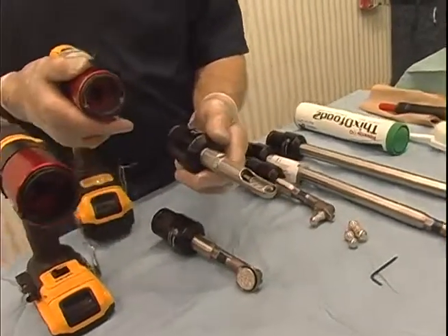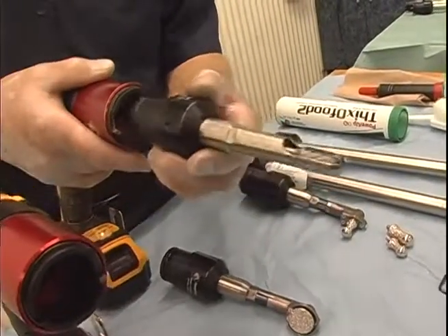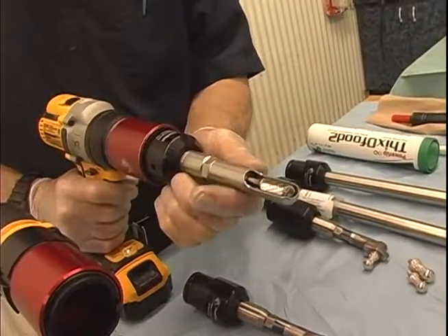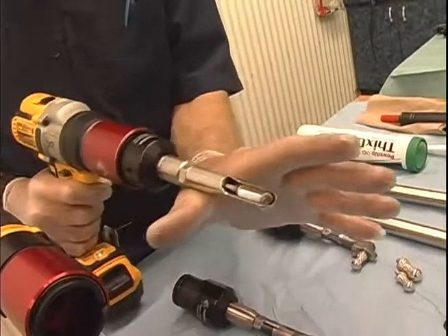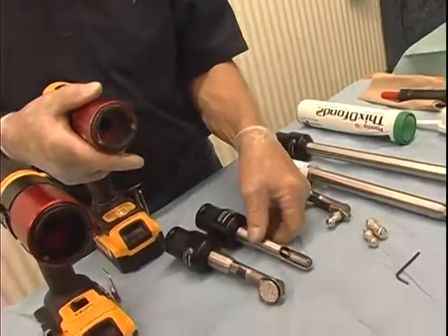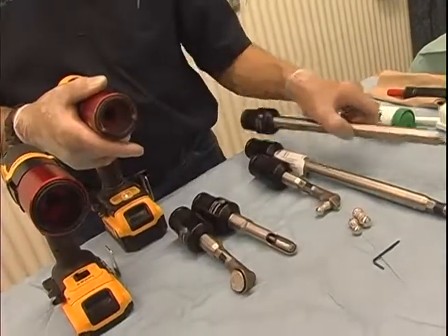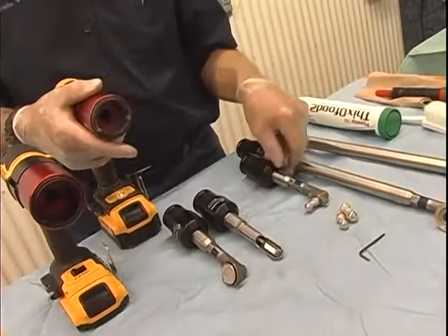This is also for incisor teeth, but it is a short rotary shaft, and it is not as easy to use on the incisors because you have to steady it. It's a little harder to keep it steady than the wheel, but it's much cheaper because this is a right angle. It costs almost as much as the full-size right angle, and this is a cheaper unit to purchase.